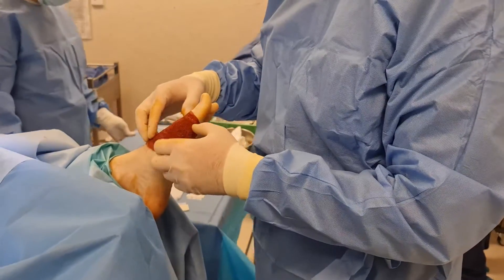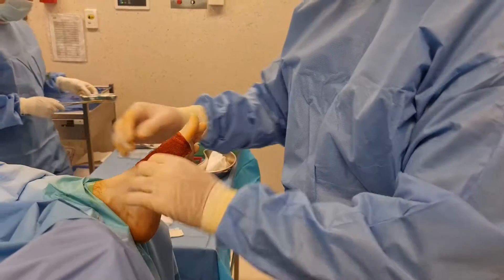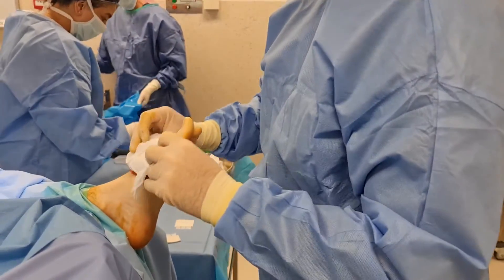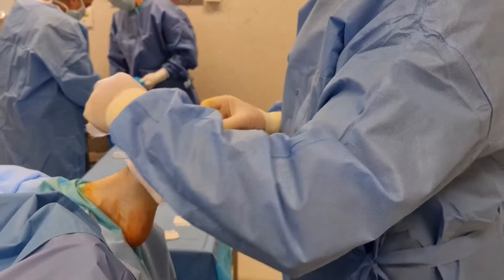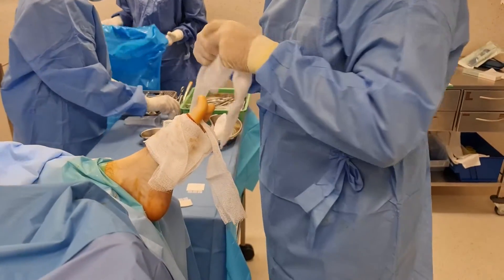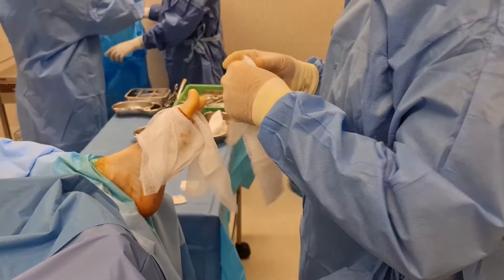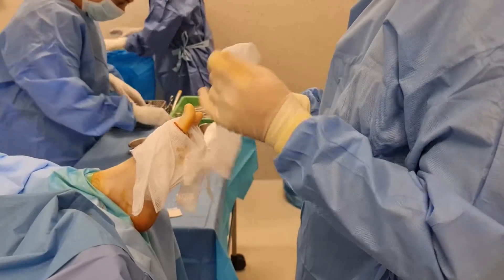Hi all. Recently I was introduced to the Recovery RX pain relief unit for relief of post-operative pain and subsequent bruising and swelling. The patient in this video had a first metatarsophalangeal joint decompression osteotomy for Hallux Rigidus. I had Charles, a podiatric colleague who now works for LMT Surgical, go through its use and application.